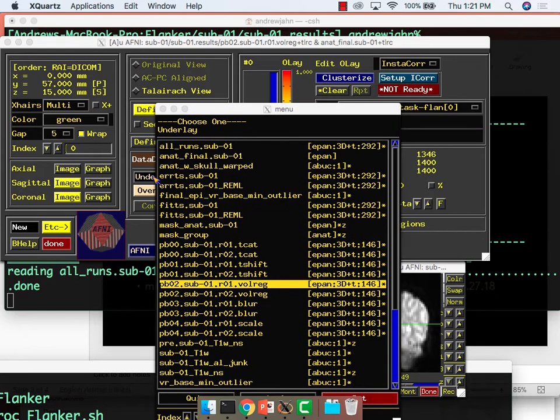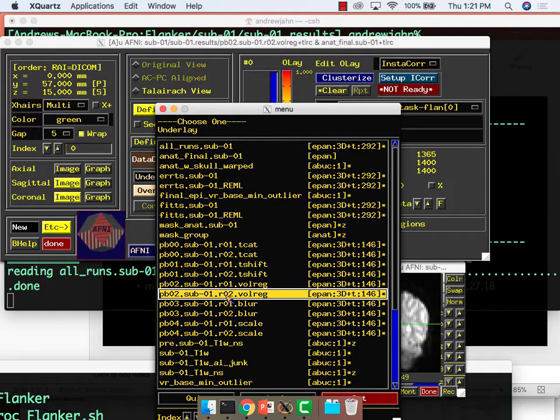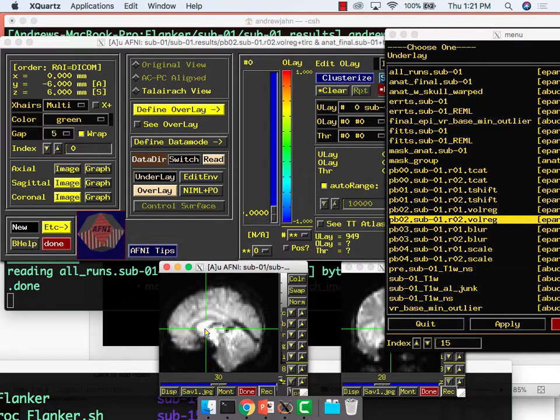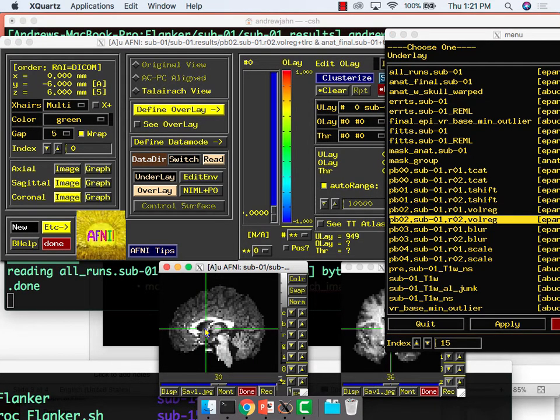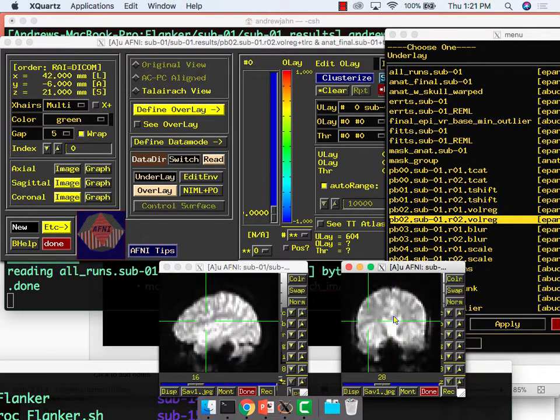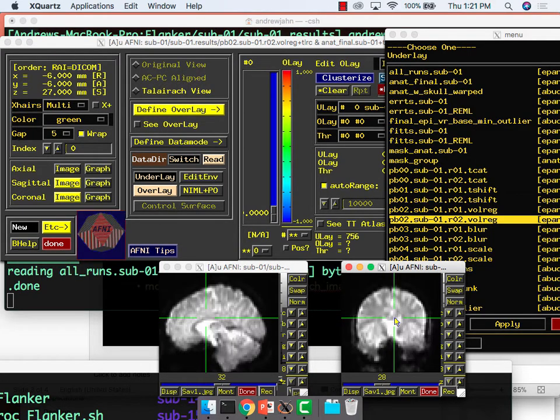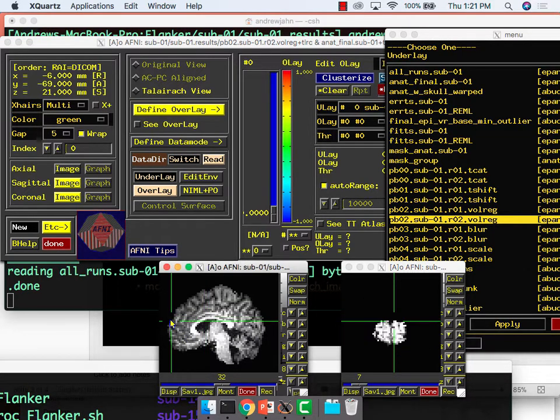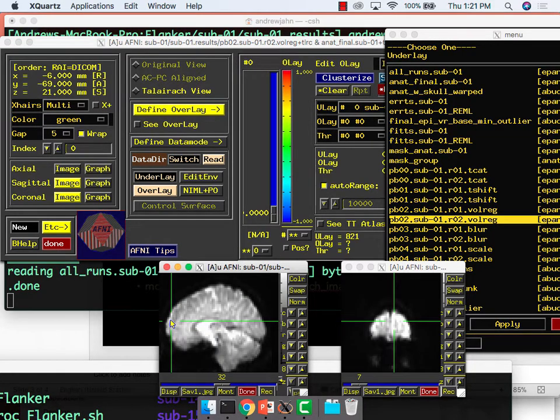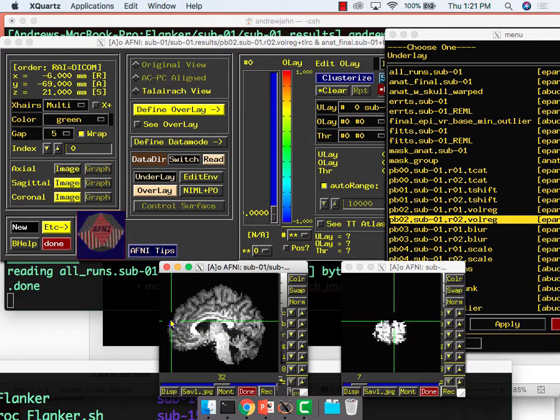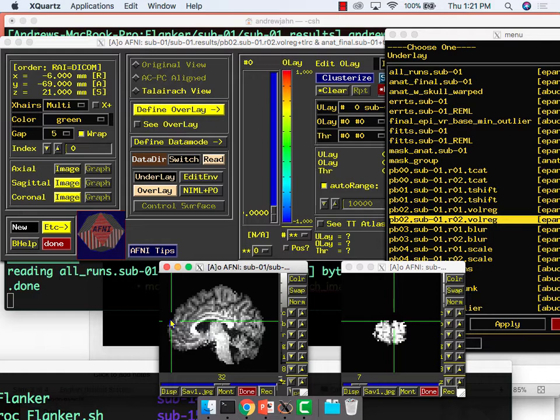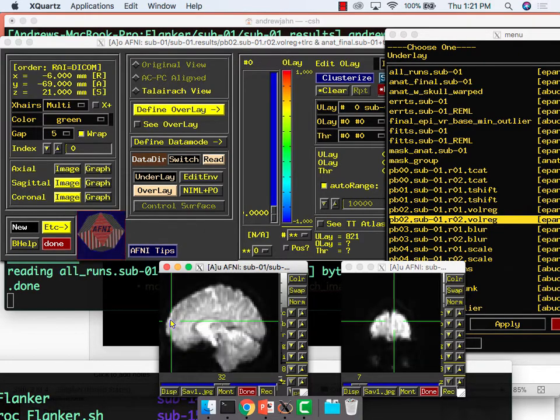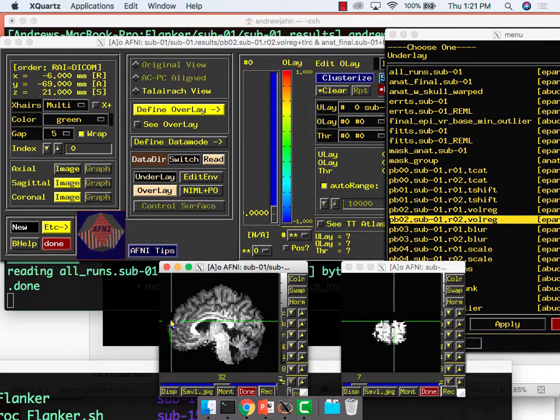If I click on underlay and I go to volt 2, same thing. The anatomical image is still loaded in memory. I'm just going to again toggle between the 2, look at a couple different slices, make sure it's okay. Now notice around the outlines of the brain you may see some discrepancies. That's okay. It's not ideal, but as part of this registration algorithm, the latest one that they have in AFNI, at least for linear transformations, you may see the outlines of the brain not matching up perfectly. It's a trade-off. They try to focus more on these internal structures.